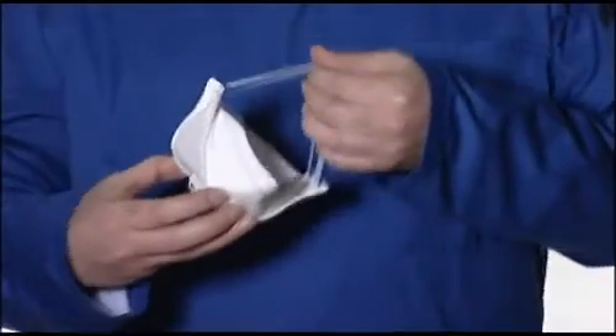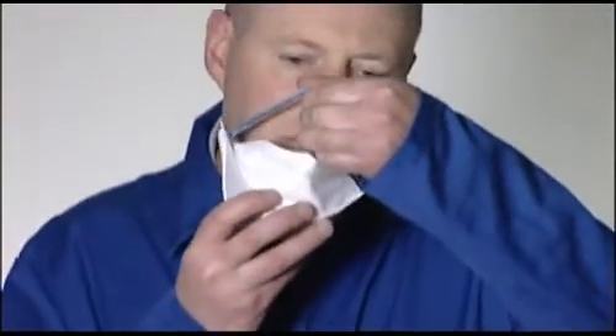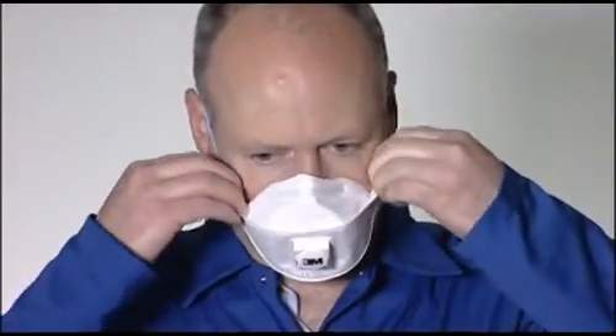3M Aura respirators should be changed if you feel breathing resistance increase, if they become damaged, at the end of the working shift, or as directed by your company's policy on respirator use.